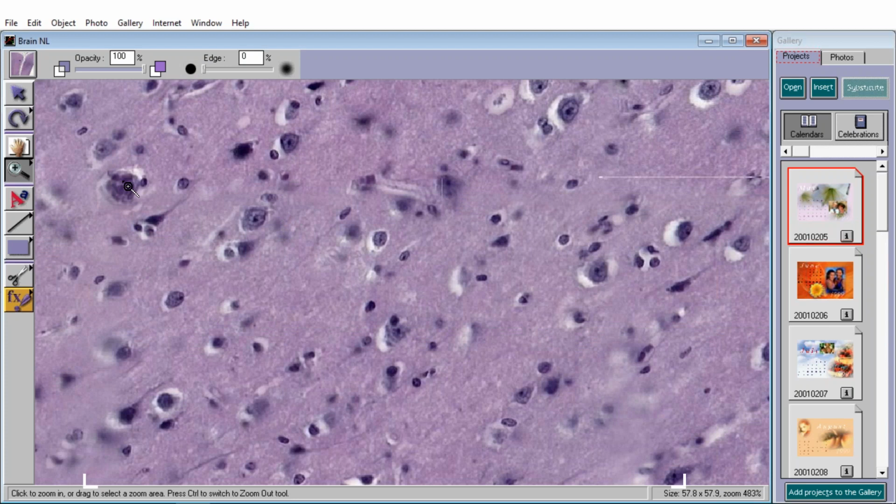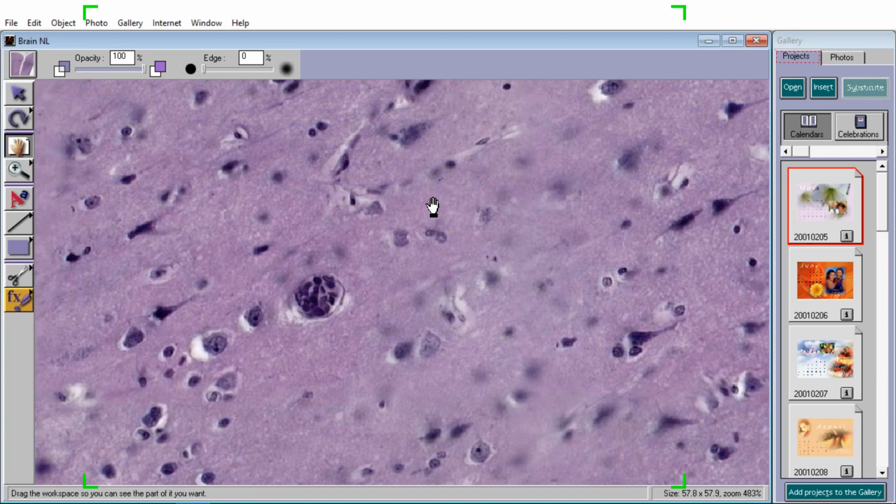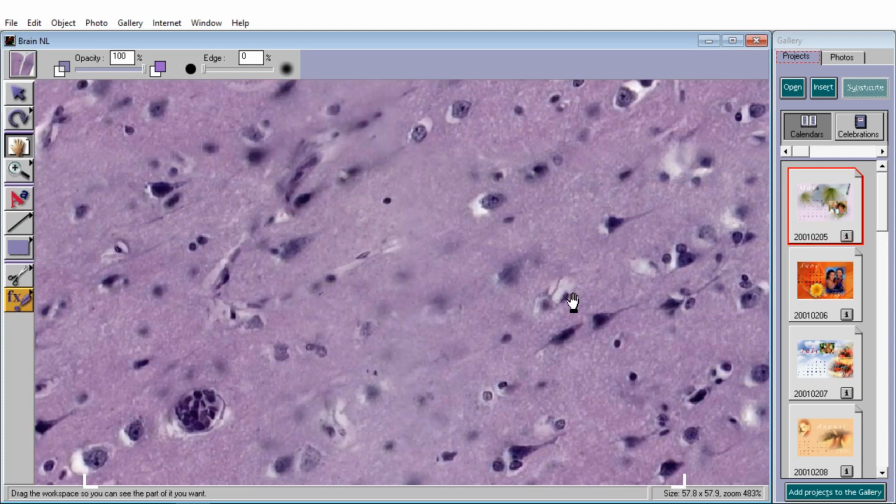So this could very easily be a neuron. It looks like there's a lot more glial cells than there are neurons. And of course, the glial cells that have a halo around them are the oligodendrocytes because they make the myelin. And then the smaller cells could either be astrocytes or microglia. But here, just so as not to disappoint you, let's find a big cell and we'll call it a neuron. Oh, that might be a neuron, okay? That's probably a neuron, that's a neuron, that's a neuron. And all these smaller cells are a variety of glia, which support it.